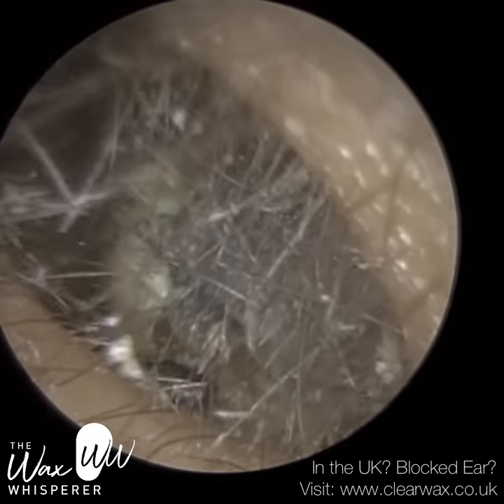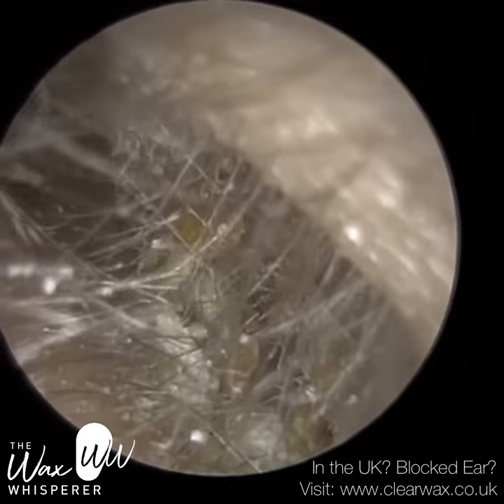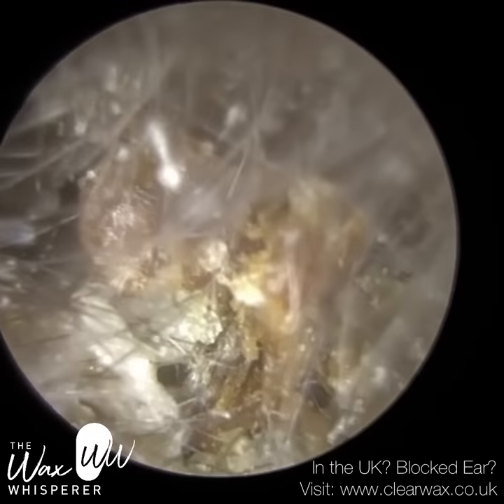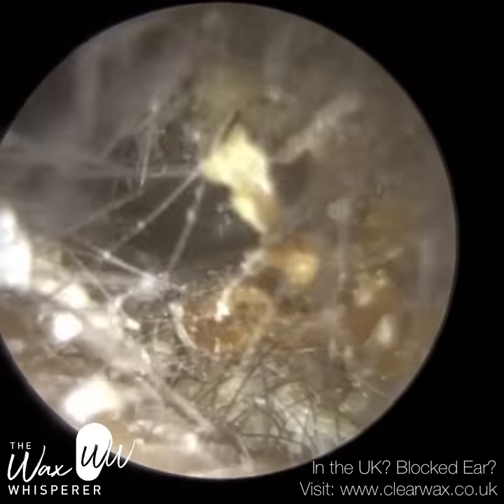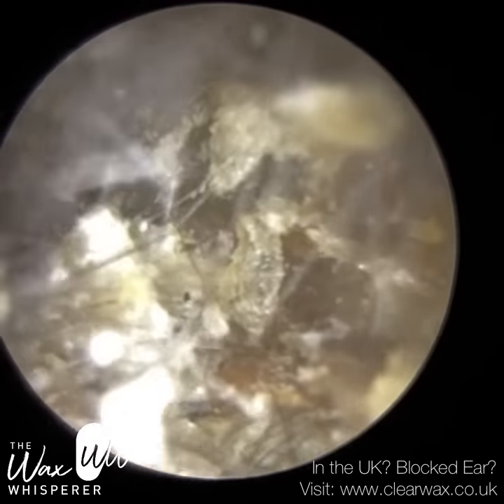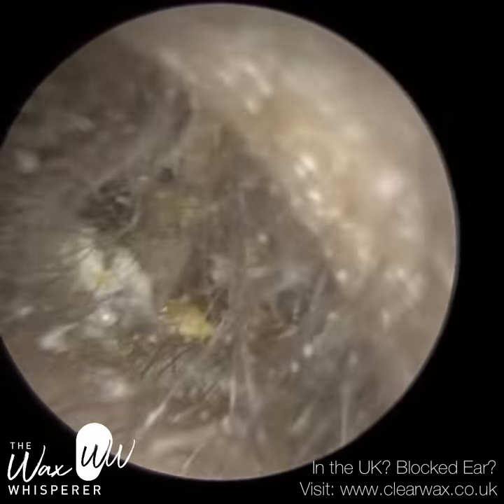We're just commencing with this, their left ear. Due to the consistency of the wax — it's really dry and matted — I immediately reverted to the St. Bart's ear hook, and this more lateral wax was actually quite hard and solid. I'm just using the hook to chisel through. Now this patient does suffer from chronic earwax impaction, so every year or so they have to have their ears cleaned.